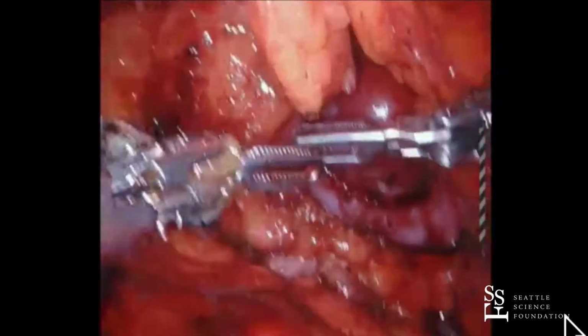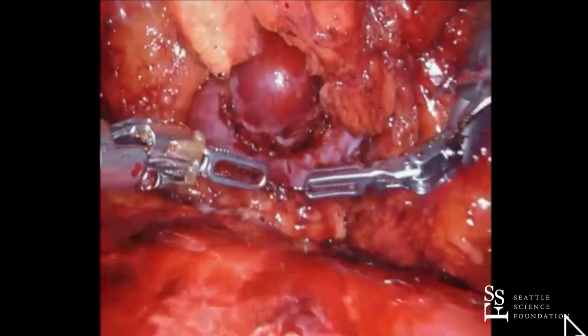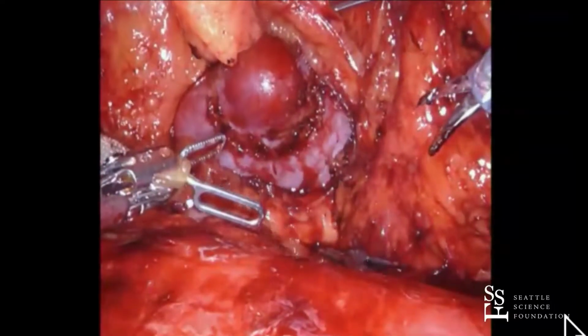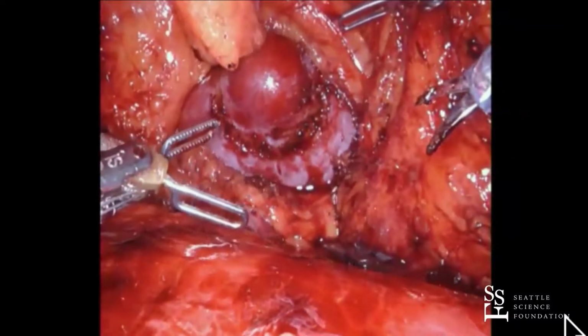All of these checks that he's doing. For me, we actually go through the process of putting the needle drivers in. So we make sure that the needle drivers have lives. You know, that's another part of our checklist. Yeah, we've checked our needles as well. Let's clean the scope. We got our left eye out.